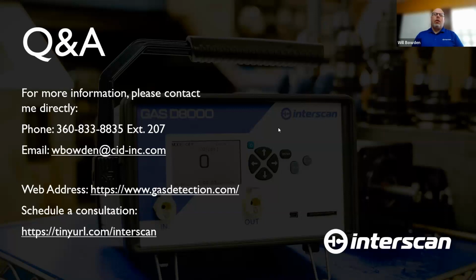Absolutely. So the next question we have here is, how many rooms or areas can be detected with one fixed system, and can you detect different gases with one system? So the sweet spot, due to the size of the display and being able to have the file holder tabs for each sensor module, is 10. Since we're communicating with RS-485, we can go up to 256 points, but then the actual display face becomes cluttered over time. So we say the sweet spot is 10 different modules.